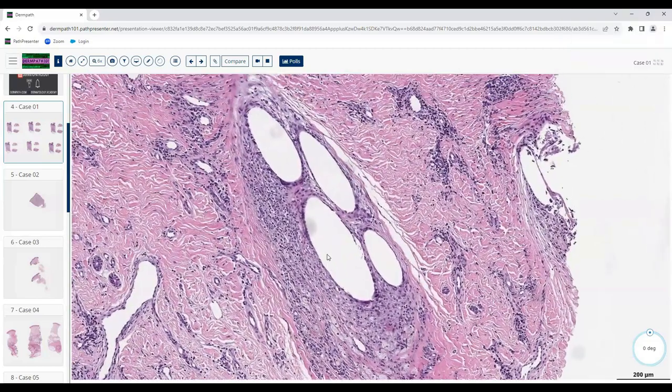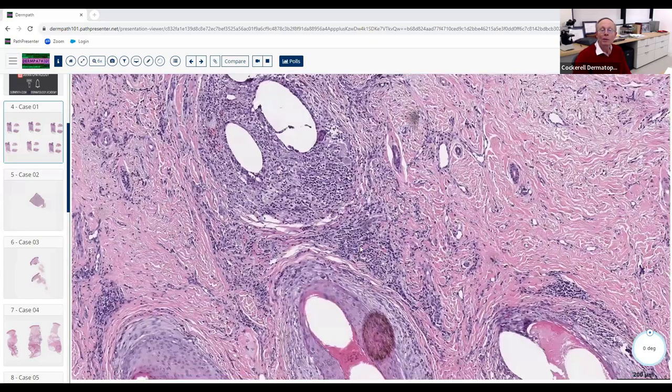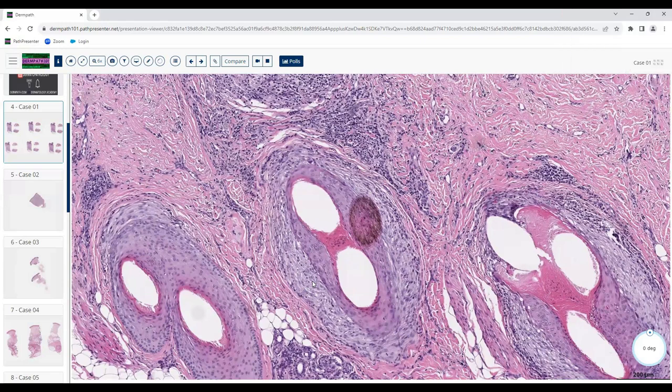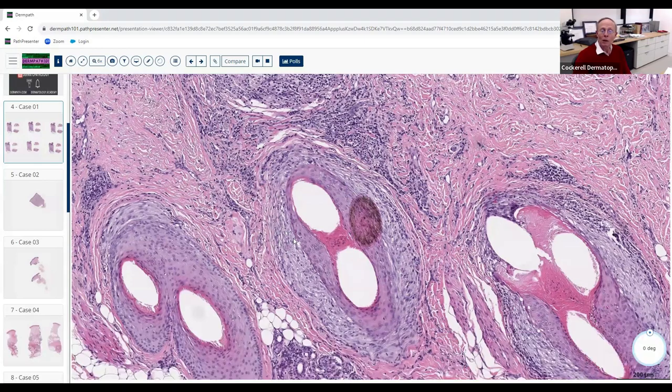What else do you notice? The hair shafts are gone — they're empty. What's this material at the outer part of this cluster? Looking at this area down here — these could look like histiocytes or fibroblasts, but the majority are fibroblasts. Notice the orientation of these fibroblasts — they look like they're arranged concentrically, almost engulfing. Exactly — this is perifollicular fibrosis.